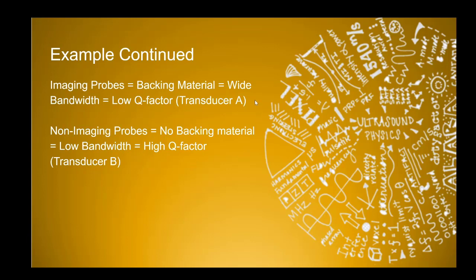When we talk about Q factor, it is important to remember that the quality factor, or the Q factor, is the quality of the resonant frequency. So what do I mean by that? And this is going to be important because it's easy to think, well, Q factor is quality, and it's quality of a picture, right? No, it's the quality of the frequency being emitted by the probe.